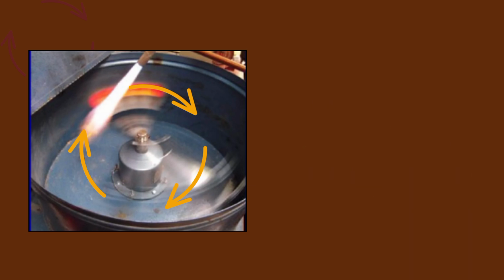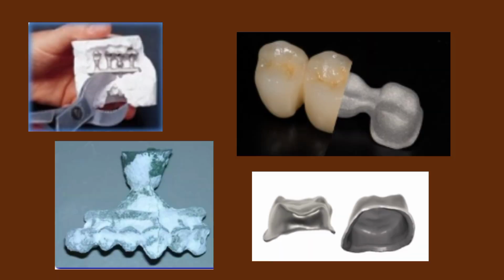After casting, cleaning and finishing are done for the final metal alloy, as was done when the wax pattern was fabricated.